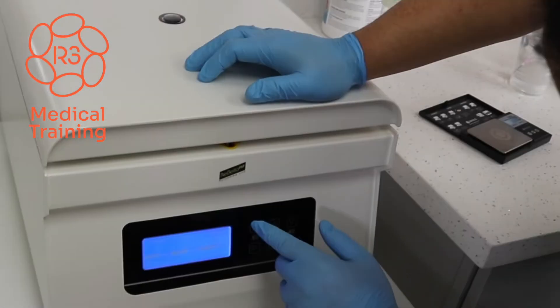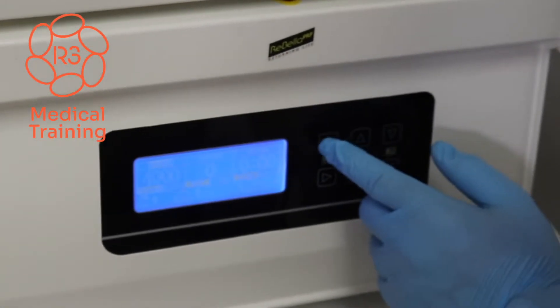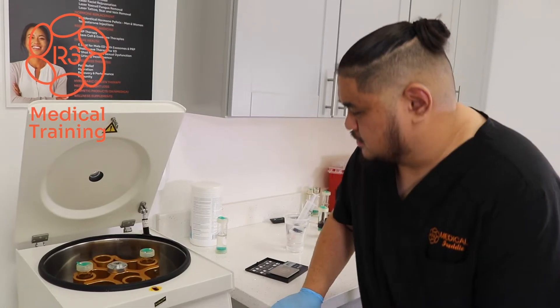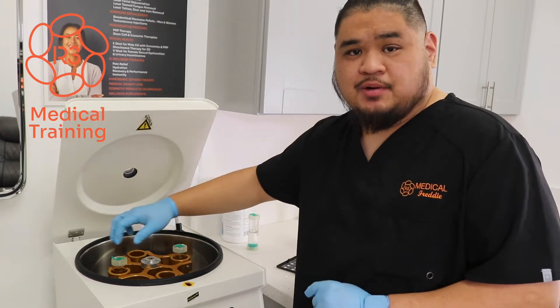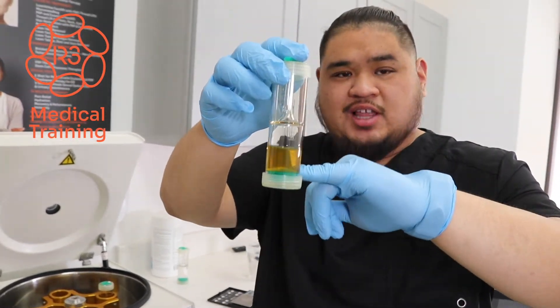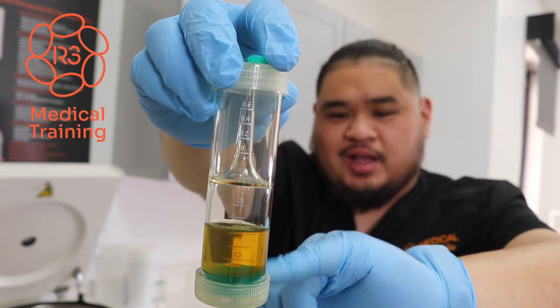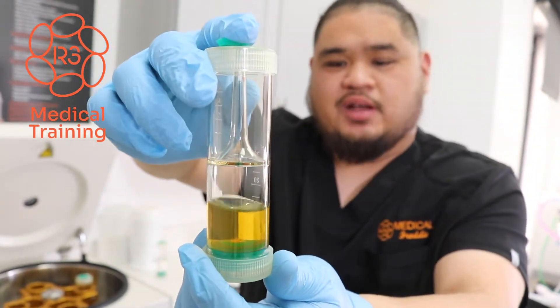For our second spin, we're actually going to spin it at 4,000 RPMs, and our spin cycle will be three minutes this time around. We're going to wait until it completes the cycle. This is the completion of the second spin — let's go ahead and take a look at our plasma sample. After your second spin, you'll notice the plasma is a lot more refined with a straw yellow color. If you look closely, you can see a concentration of the platelets — the buffy layer in the middle — which signifies that we've concentrated as much platelets as possible to give us a pretty effective PRP product.